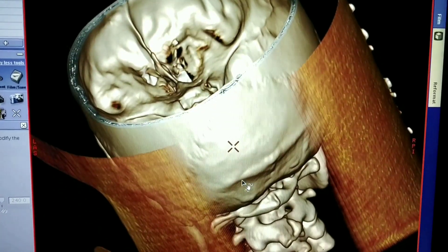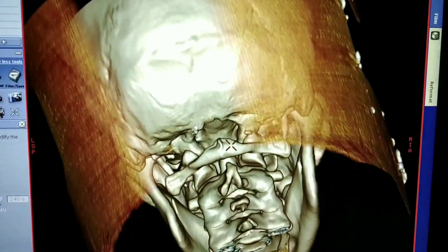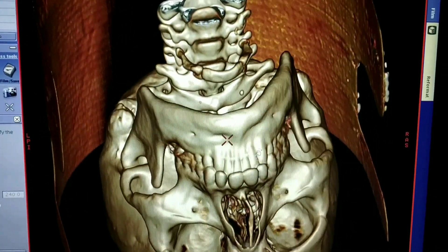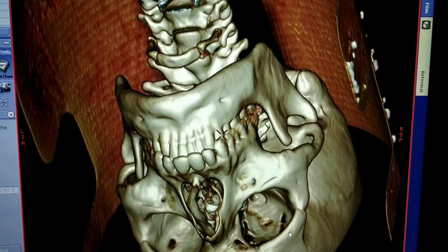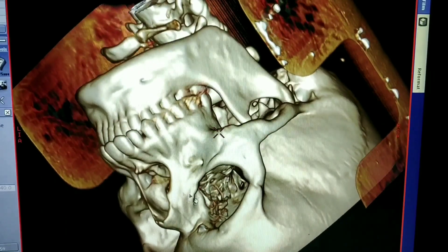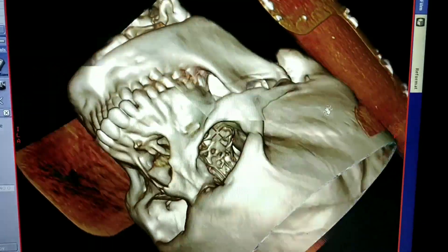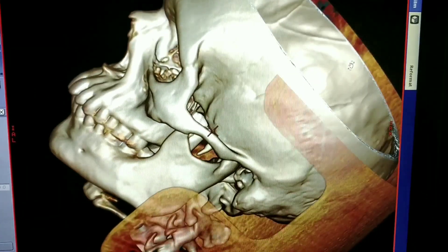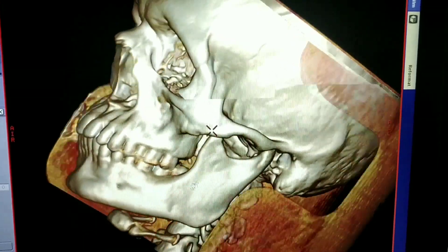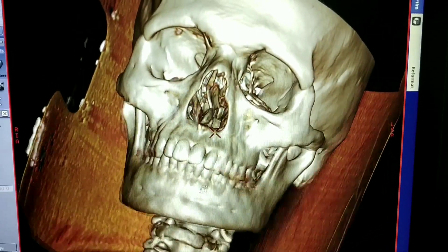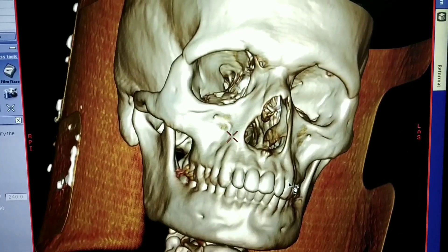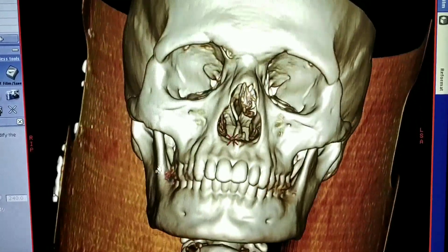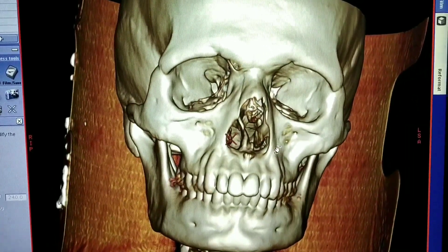The 3D CT is a surface rendering technique performed with the help of a sophisticated software program. The procedure consists of obtaining plain axial scans of the region of interest. The computer is then provided with a carefully selected threshold attenuation value. The program scans each CT scan line by line and records the exact coordinates of each pixel that shows an attenuation value higher than the chosen threshold.